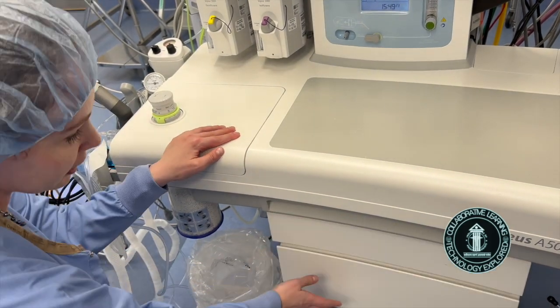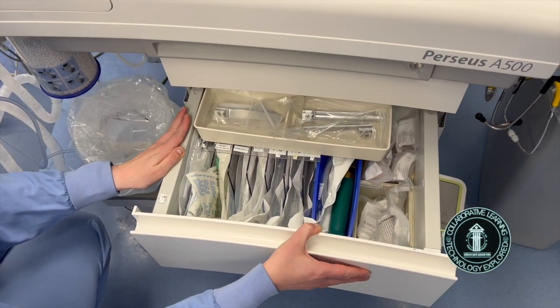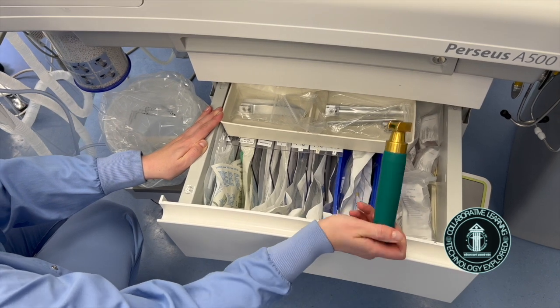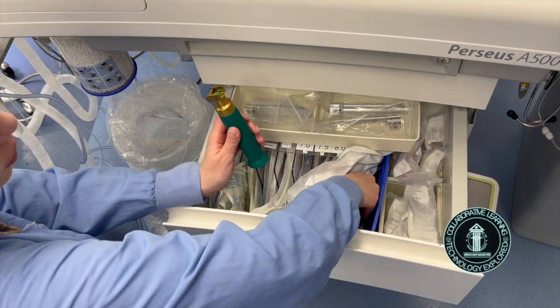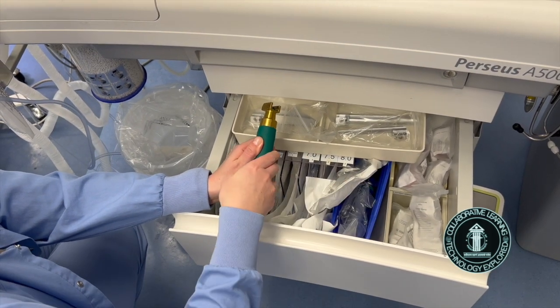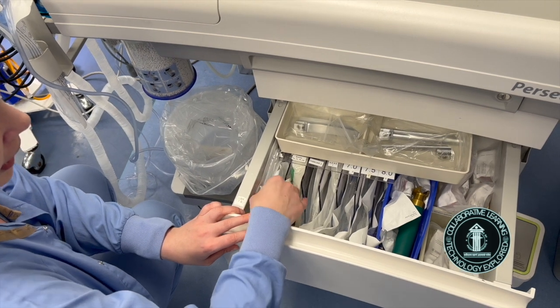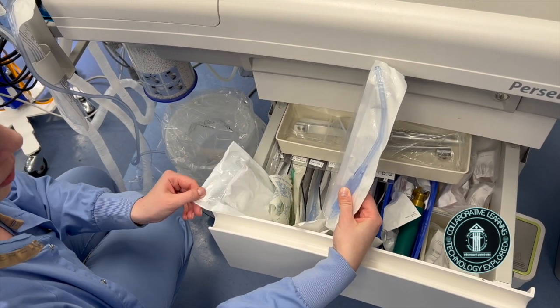One more drawer that we have here has the airway devices. We have different oropharyngeal airways here, different adult sizes. We have two different kinds of blades. We have this blade and one more blade here, and we have different adult sizes of Miller and Mac blades. Also, we have different sizes of tubes from 6 to 8, and we have nasal airways and a big Yankauer suction that is here, and different smaller size suction.